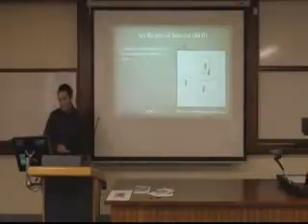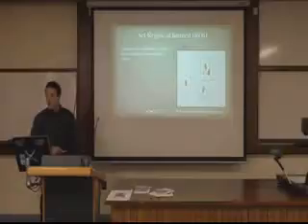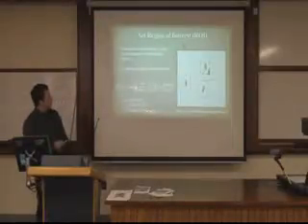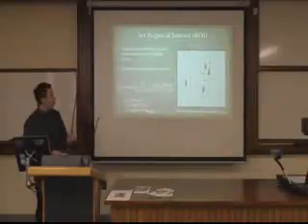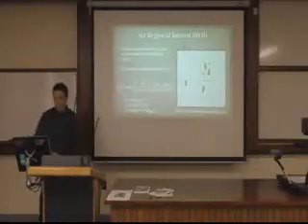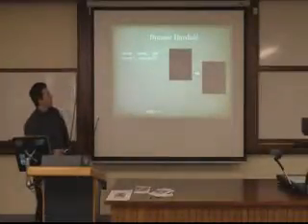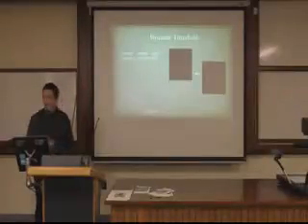So now that these regions of interest have been projected in, they are in the continuous metric, so they don't make sense to an image. We need to convert them into something that makes sense, which is rows and columns. And so the transformation is just that, using this scaling factor again. 1 over p, where p is the pixel pitch, which was 0.392 millimeters, and that just made them reference rows and columns of the image. And so once I've set my regions of interest, I use a dynamic thresholding, which is, as I explained, what thresholding was.